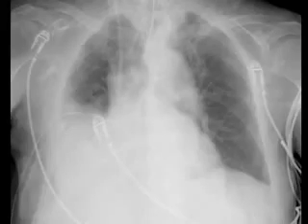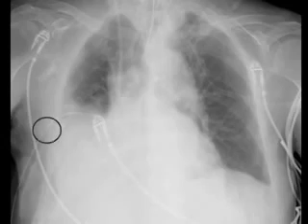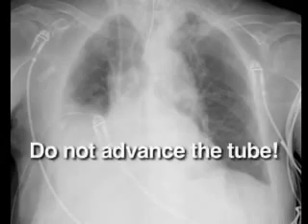Otherwise, it is sitting outside the pleura and not draining effectively. This is an indication to replace the tube altogether. Do not advance the tube into the chest, as this can introduce non-sterile tubing into the chest cavity.